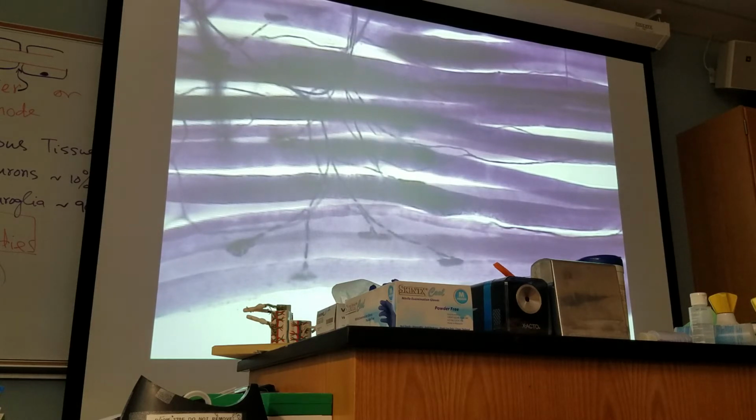Do you have your book here? No, it's on the computer. I will show you. To answer your question, I'm not going to ask you this. Can you see that? This is the axon, and this is from another neuron. This is axodendritic, on the dendrite. On the cell body it is axosomatic. I will show you on that model also.